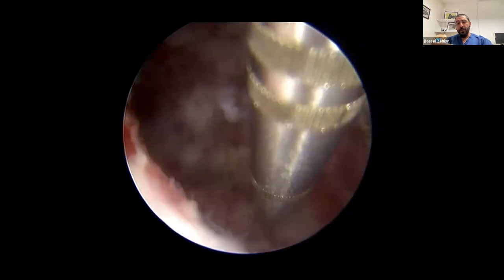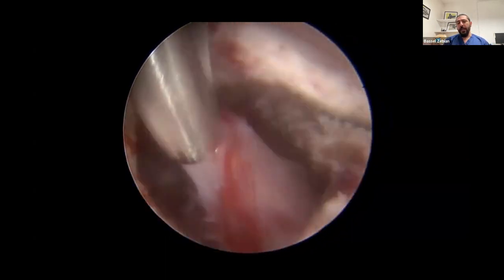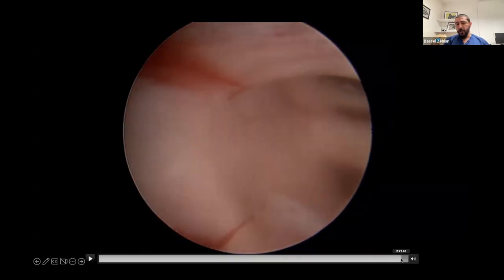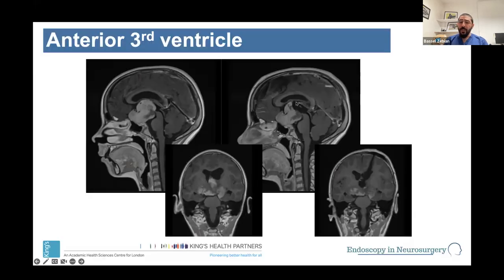And one way to do that is to try and push the tumor to one side to see where the limits are. And with this, we were quite fortunate that we were able to then see all the way back to the posterior third ventricle with, again, the tectal plate, pineal recess, habenular commissure above, and the aqueduct. And it's a small amount that we did. It was only 2 or 3 hours operating, and that's the only bit we took out.